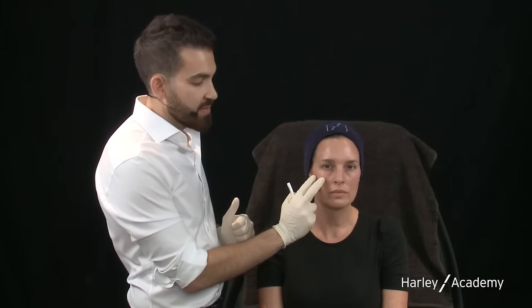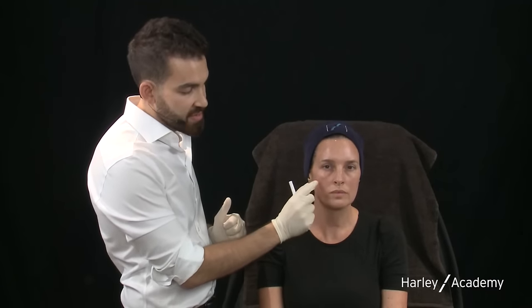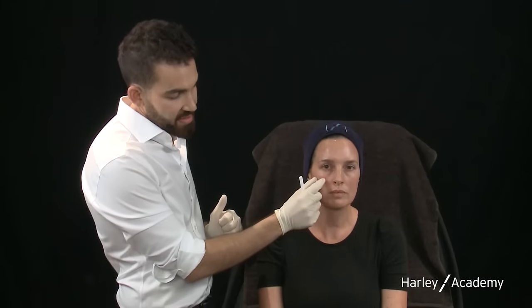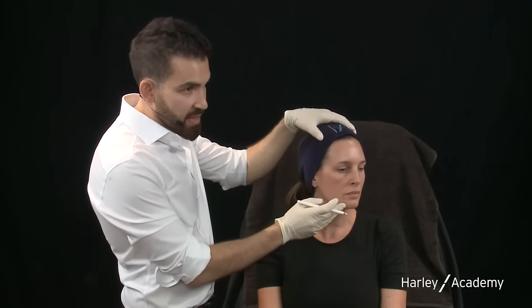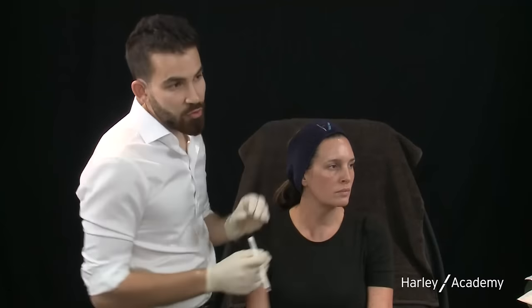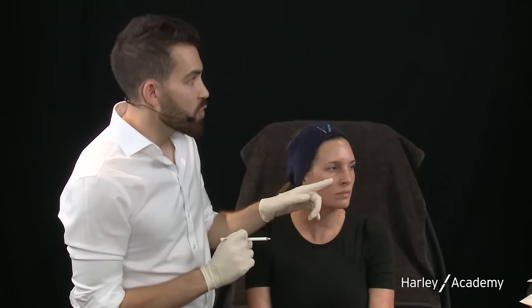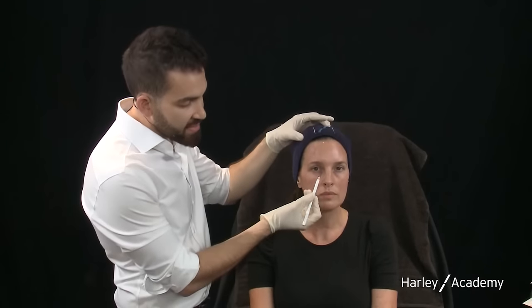We've got a nice prominent apex here and this doesn't require any augmentation. It's nicely defined so we're going to leave that as it is. What we do have is some flattening in the mid face. We have the superficial fat pad and the deep fat pad, and one of the first areas to lose volume with aging is the deep medial cheek fat — this is a potential target today to create a more youthful mid face.